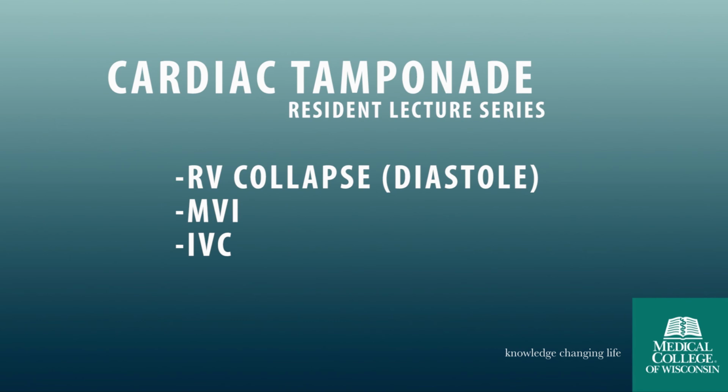In summary, if you have a pericardial effusion, you can assess for cardiac tamponade using ultrasound. The things that I like to look for are right ventricular collapse during diastole, mitral valve inflow variation greater than 25%, all of this combined with a dilated IVC.